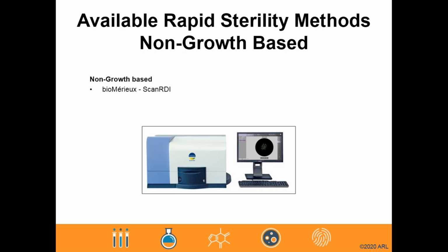This platform combines methods of viability staining as well as solid phase cytometry. With this system, the test sample is filtered through a polyester membrane where any microorganism retained on the filter is then labeled with a non-fluorescent substrate. Within metabolically active cells, the substrate is enzymatically cleaved to release a fluorochrome, which is retained in cells with intact membranes. A laser scans the surface of the membrane within approximately 3 minutes, and viable cells are then detected.